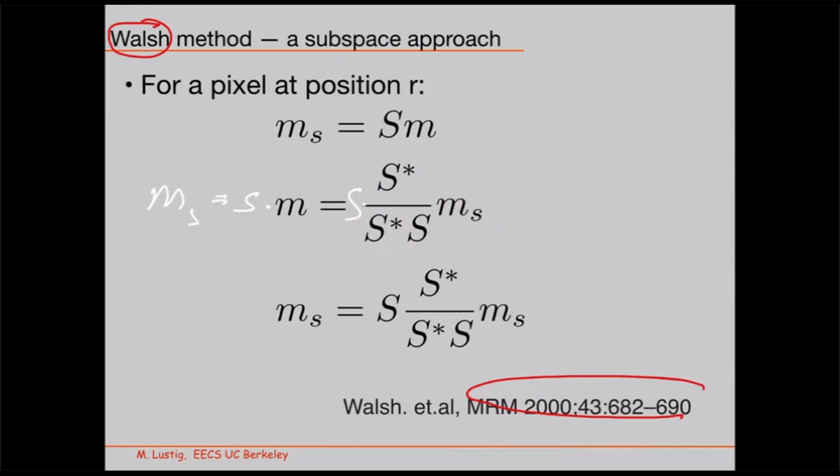That should give me exactly the coils. Does that make sense? Again, I take the individual coil images, combine them into a single one, and then multiply again by the coil sensitivities, and that will give me the individual coils. So basically this is a null operator, it does nothing. It's kind of like identity, right? Okay, so this is a good equation, right?